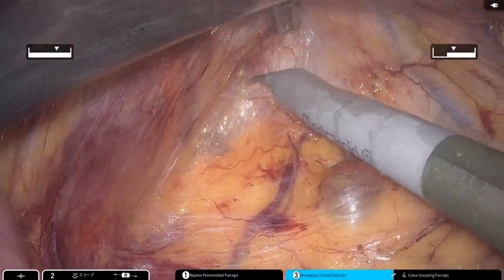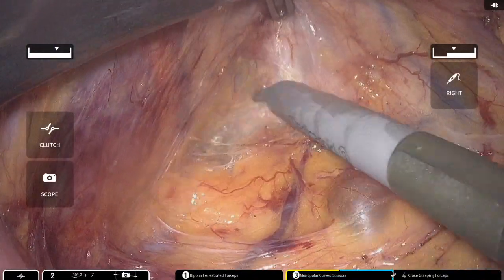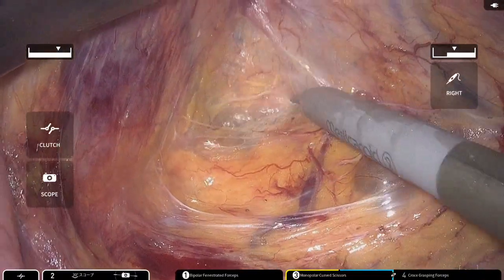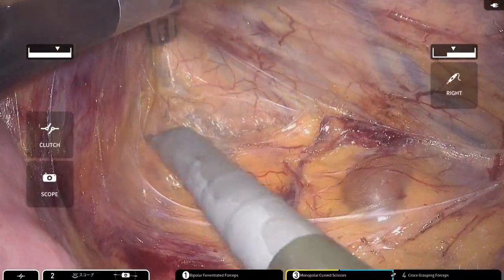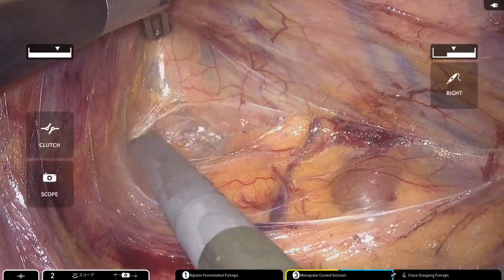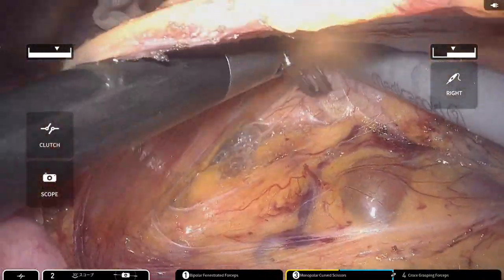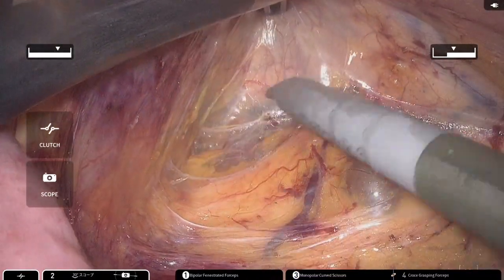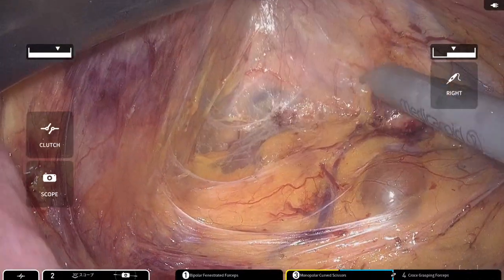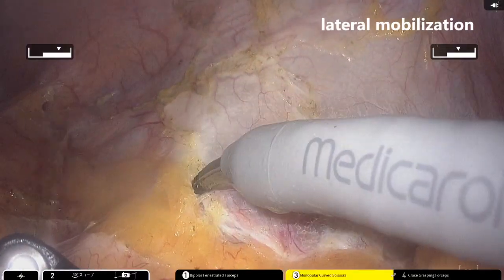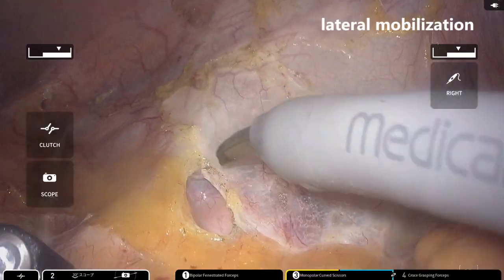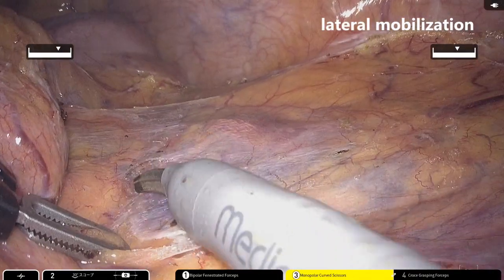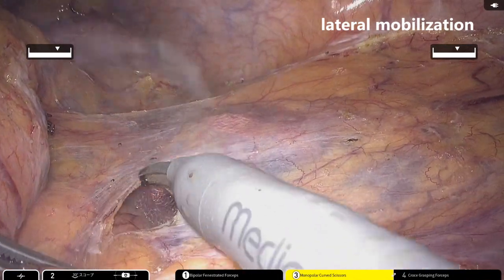Additionally, broad mobilization of the mesentery towards the lateral side was achieved. The lateral mobilization was extended to the splenic flexure, creating communication with the medial dissection plane.